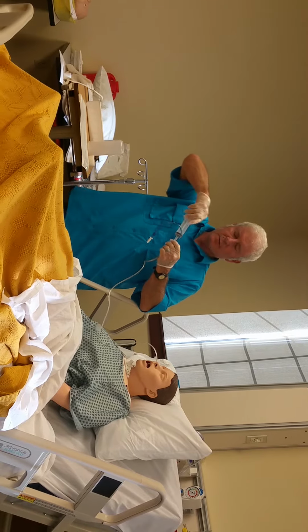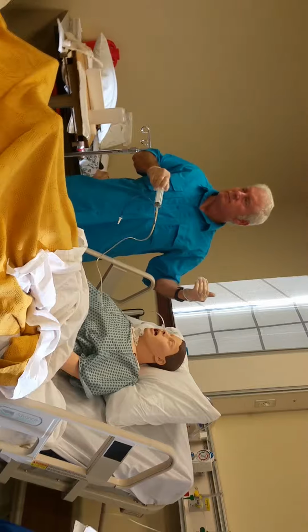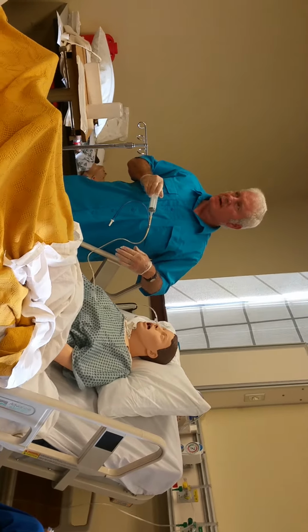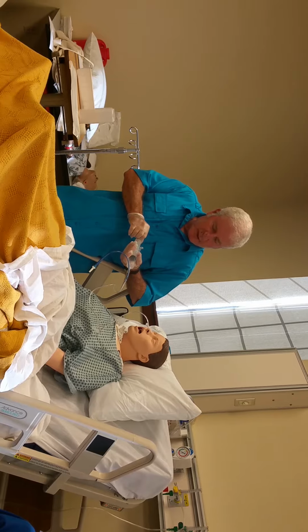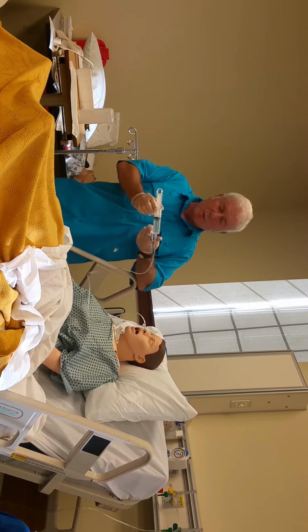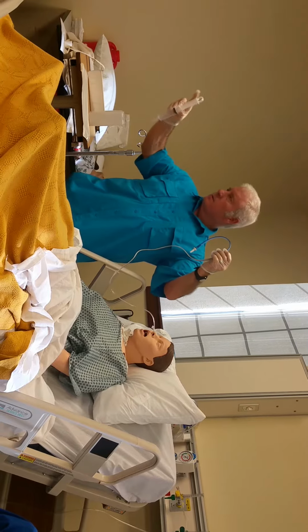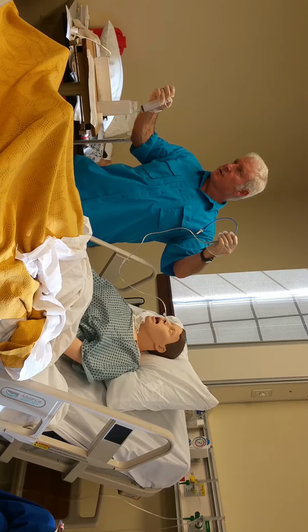We're checking residue. If the doc wants him to have, I don't know, 120 mils of something or 200 mils of something every 4 to 6 hours, you want to make sure that the patient's digesting it. So what you do is you stick this in here and then you actually pull the stomach contents out. You'll have to have a container in case it's more than the syringe will hold. This is a 60 mil syringe. So you measure it, okay, so there's 60. You put it in some kind of specimen container, so you can take it back out.